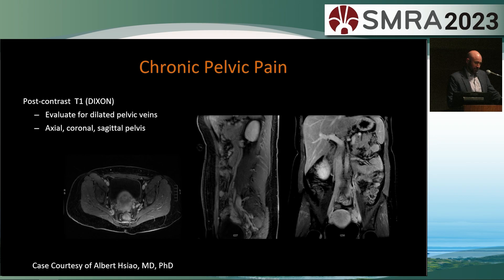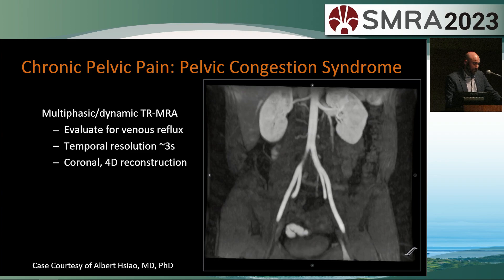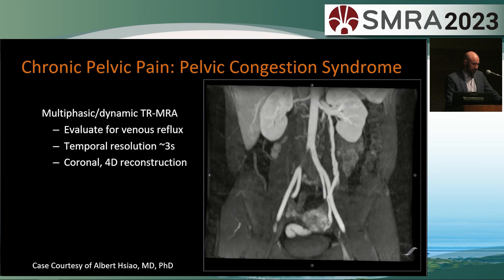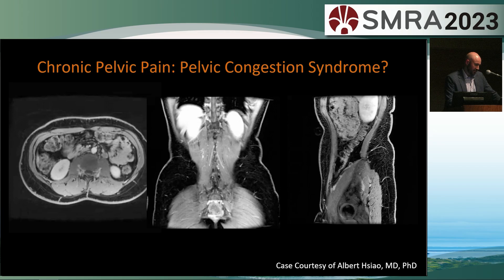A case from Albert Sal at UCSD: a patient with chronic pelvic pain. Axial, sagittal, and coronal delayed phase post-contrast images show pelvic varicosities, an enlarged ovarian vein coming down to the varicosities on the left, and an enlarged right-sided ovarian vein. In a patient with chronic pelvic pain, you want to determine whether there's a connection between pelvic varices and the left renal vein. This image nicely shows retrograde flow in the left ovarian vein going down to the pelvis, supportive of pelvic congestion syndrome, which can be treated with coil embolization in IR.